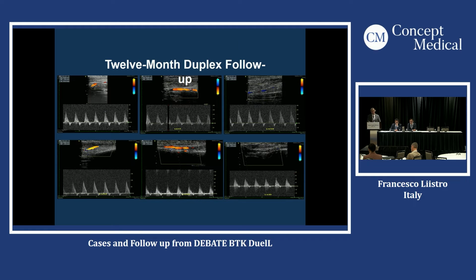I show you because this is really incredible. We had a pulsatility flow. We have a pulsation on the dorsalis pedis, and you can see that the flow is optimal. It's almost triphasic from the proximal to the ostium to the distal segment of the anterotibial artery. So this was really an excellent experience with the Magic Touch balloon.